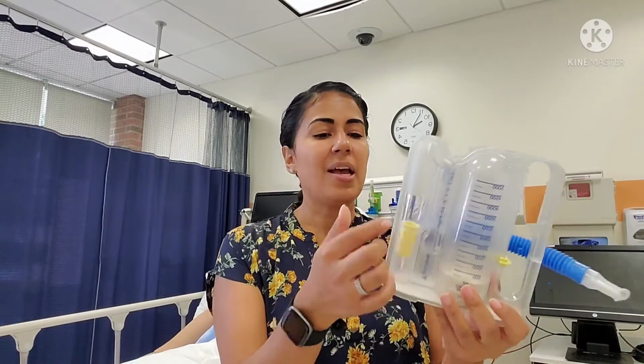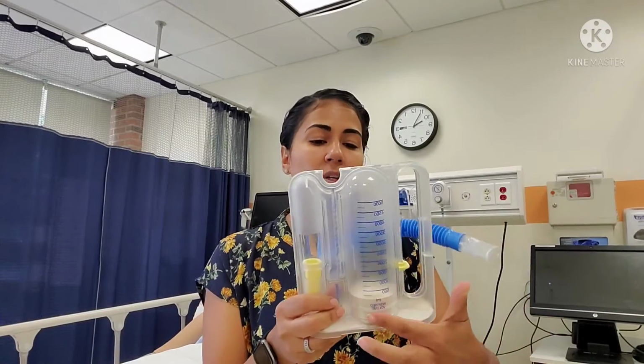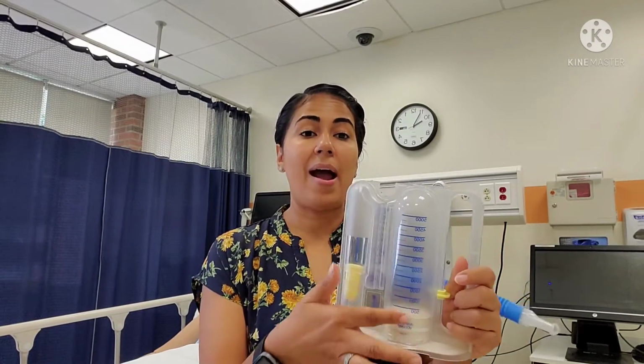We want to take a nice, slow, steady, deep breath in, hold it for a few seconds, and then release it, okay? And during that time, this little yellow indicator should stay in this window. And that's what we're looking for. We're not only looking to see how high they can get this, but we're also looking to see if they're able to hold that breath. Now, in most cases, in the beginning, they're going to struggle with this a lot.